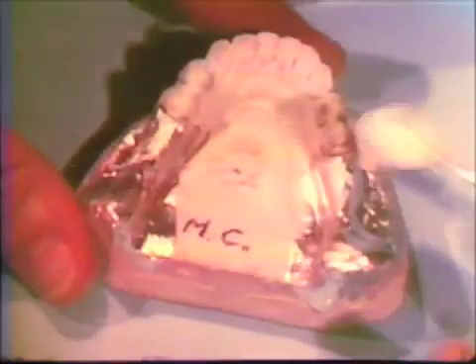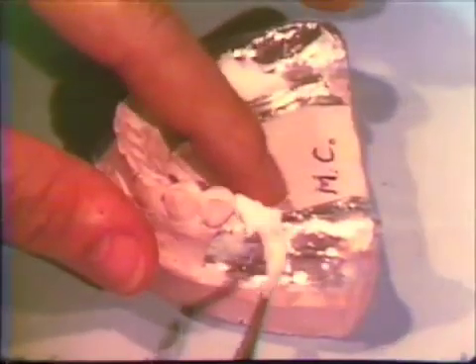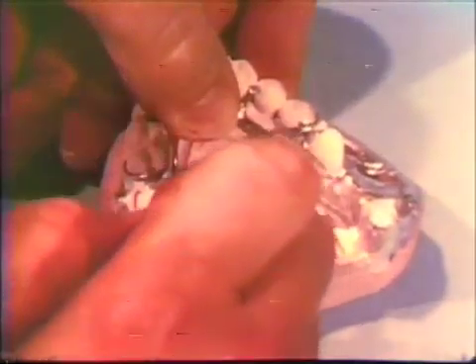Temporary bases are now added to the framework. Tin foil is used as the separating medium. With tin foil properly adapted, a small portion of self-polymerizing acrylic resin is placed just distal to the abutment tooth on either side. The framework is then seated into this soft material. The remainder of the temporary base is formed and allowed to cure.